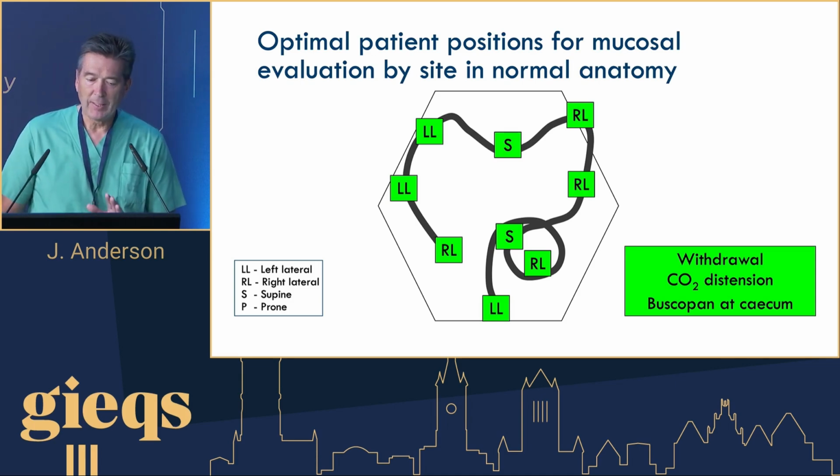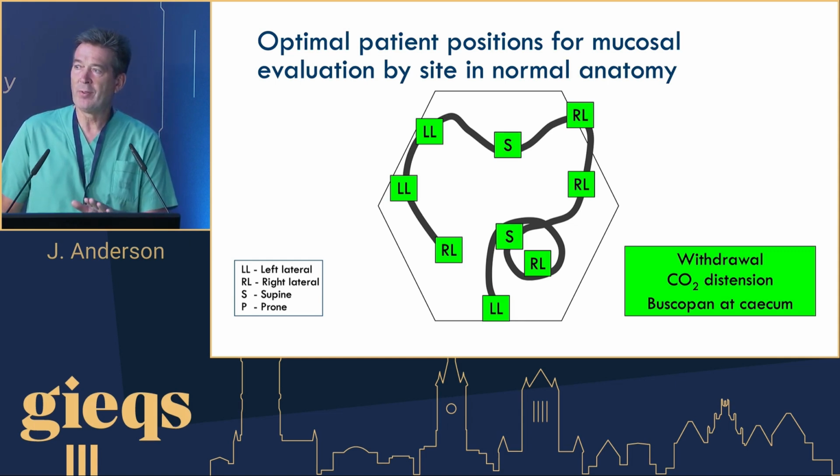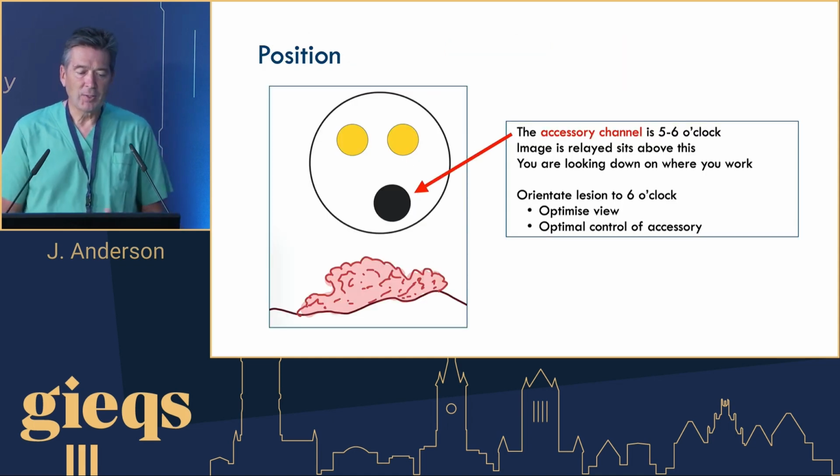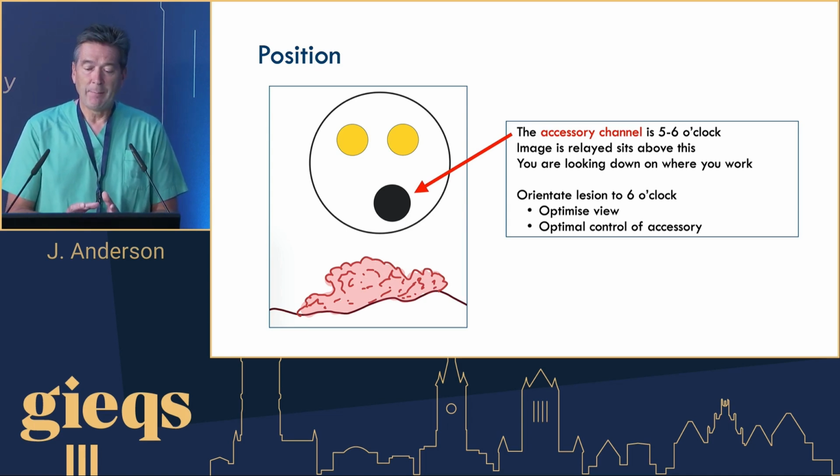So I'm going to leave that up. This is probably the most important thing if you're doing conscious sedation. You need to roll the patient in these positions to maximize your view. It will also help in terms of positioning the polyp and moving the fluid.